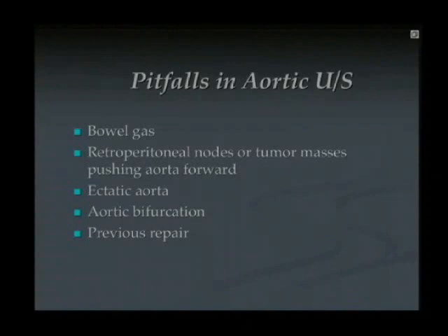Now, I'll tell you, if you think they have an aneurysm and they're stable right now, that doesn't mean they're stable 15 minutes from now. And I'll tell you, 30 minutes head time for that vascular surgeon and the OR team and blah, blah, blah, that is still powerful for that individual patient. So I personally would like to quickly scan them if I'm really, really suspicious of aneurysm. Yeah, I do think it helps you. Because, again, every minute in that sort of a case is percentages onto your mortality. Yes, question.